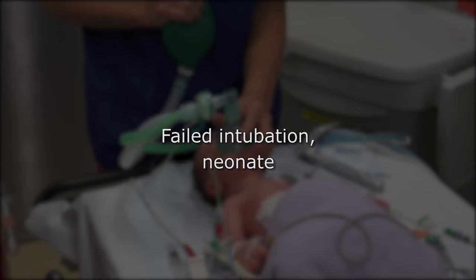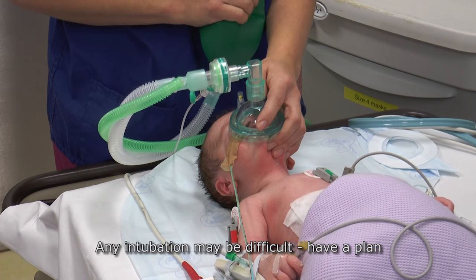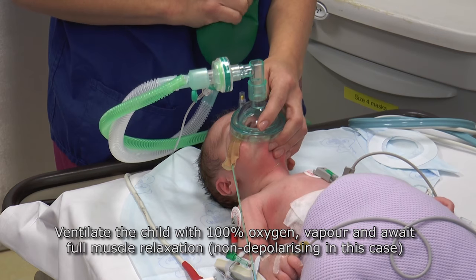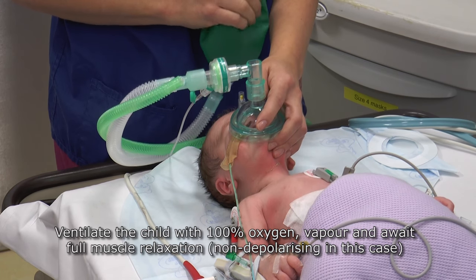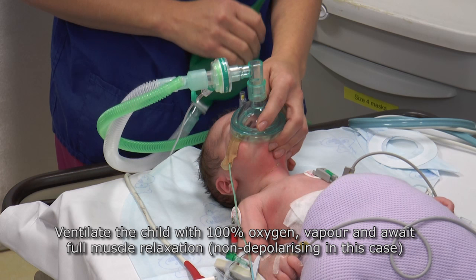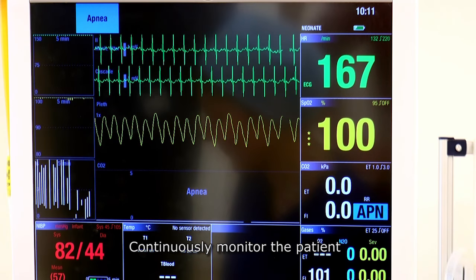Failed intubation, neonate. Any intubation may be difficult — have a plan. Ventilate the child with 100% oxygen vapour and await full muscle relaxation (non-depolarising in this case). Continuously monitor the patient.